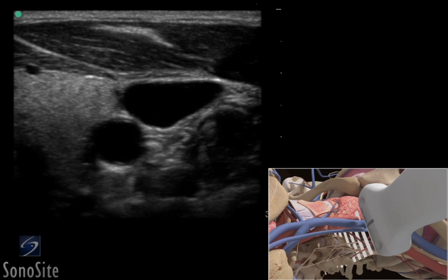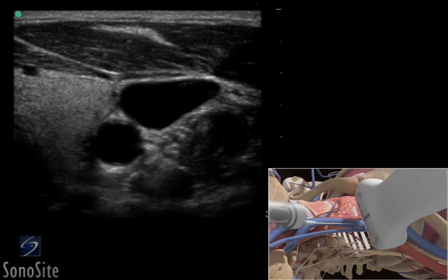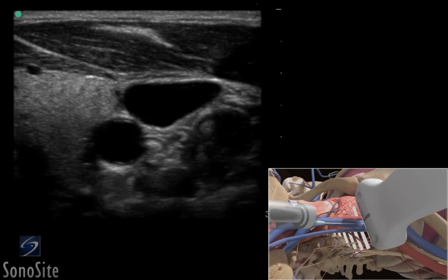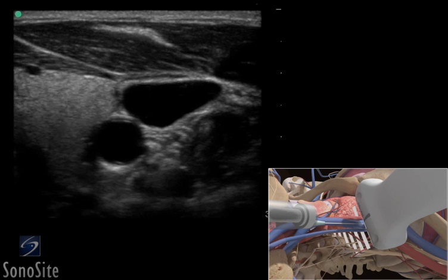Adjust the transducer so it is centered over the internal jugular vein. Follow the needle entry by slowly sliding the transducer in the direction of needle advancement. The needle will appear as a small bright hyperechoic dot.